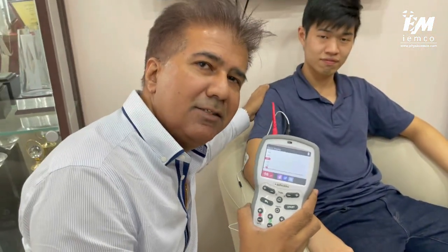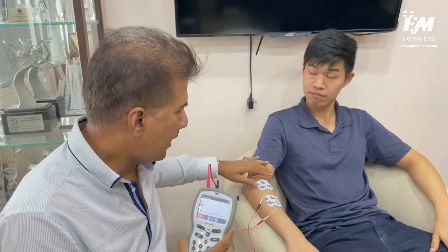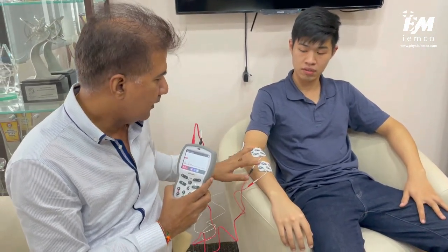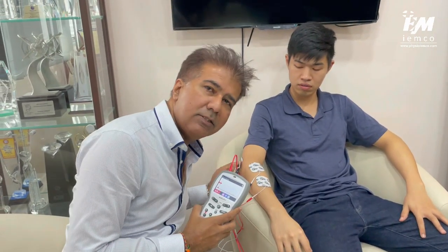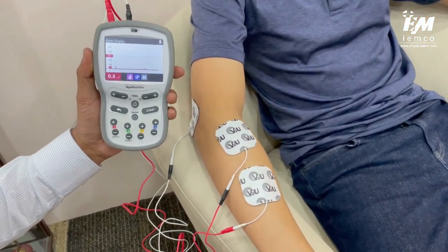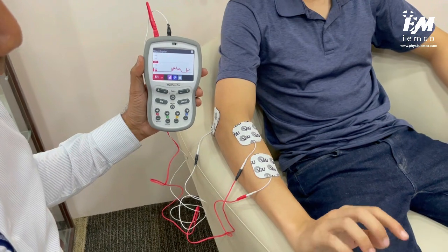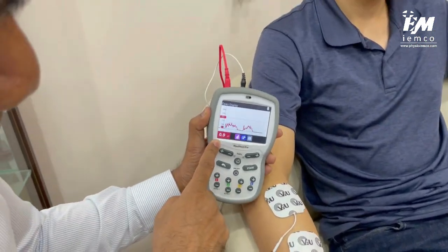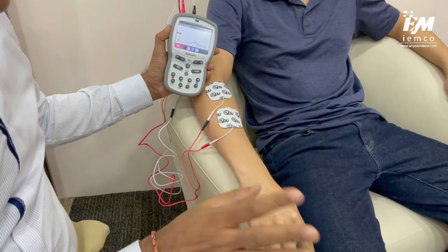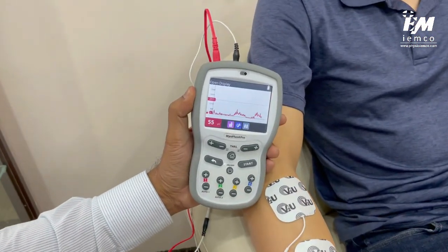Our volunteer JJ is going to demonstrate. For ease of understanding, I'm placing the electrodes on the forearm because the wrist joint movement is very easy to see. We have two active electrodes here and the reference electrode kept aside. JJ, can you gently lift your wrist up and down? You can see the numbers changing — up and down, just gently. JJ is acting like a weak patient with poor strength, moving his arm up and down with only a little bit of muscular activity.